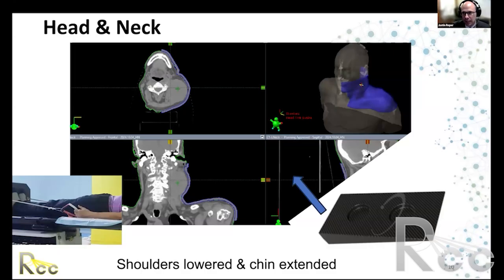And further, there may be additional air gaps because of that hardened mass not being quite as snug against the bolus. On the other hand, if you were to place the bolus on top of the mask, then you necessarily have a perforated boundary of the thermoplastic mask with small air gaps between the bolus and the patient. So whenever possible, I recommend positioning the bolus directly on the patient's skin at the time of SIM and then building the mask around it.